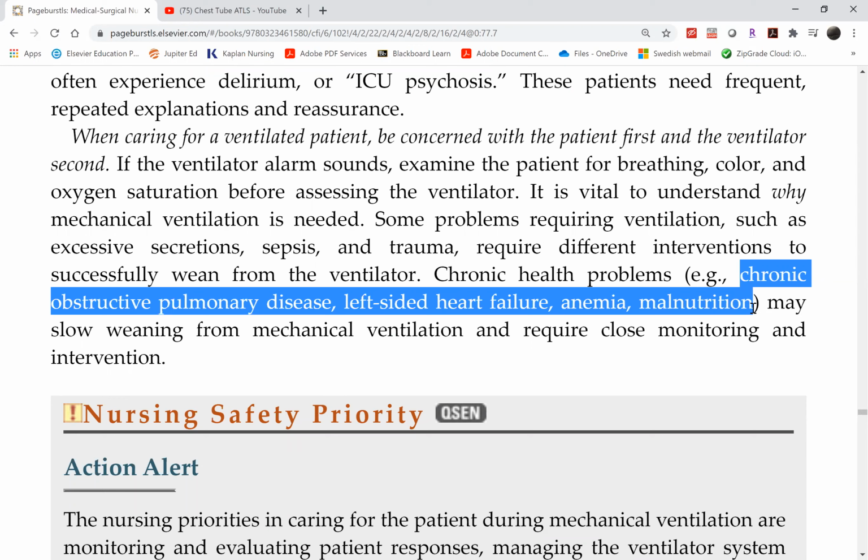These are natural consequences the longer the patient is on a ventilator. Remember, this is positive pressure ventilation. This is not the same as our body, which are negative pressure ventilators. We naturally take in a breath passively. Our diaphragm contracts down. Air is sucked into our lungs passively with no effort, no pressure, because the pressure inside our thorax is negative compared to the atmosphere, which is positive pressure.